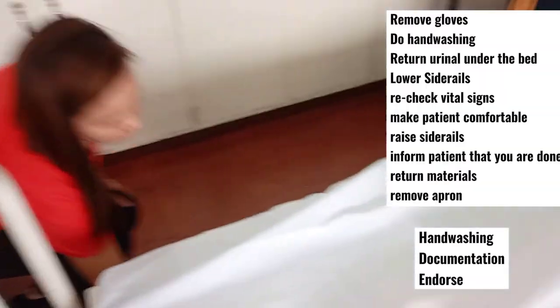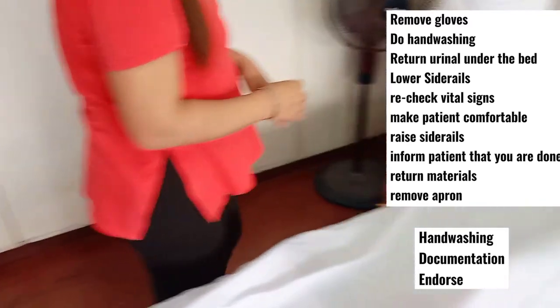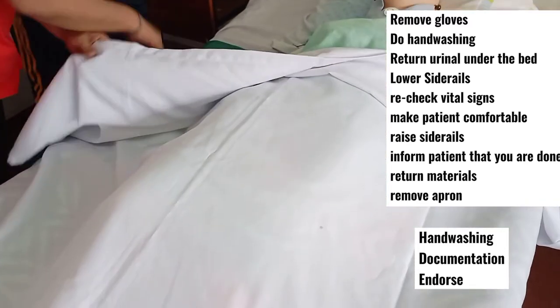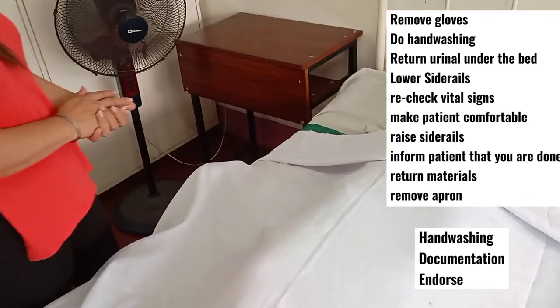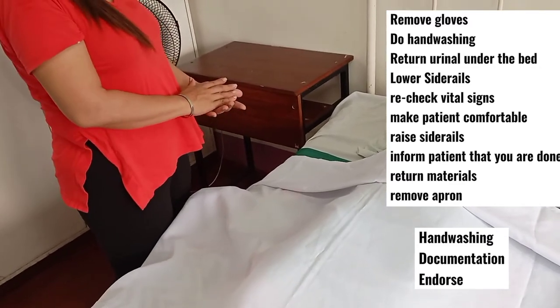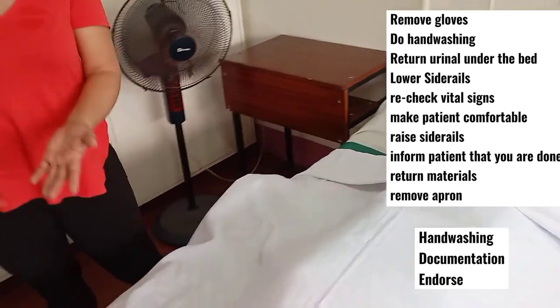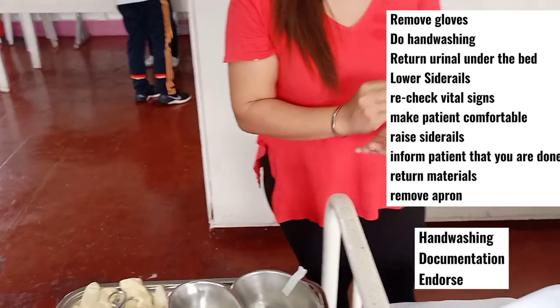Remove your gloves and recheck the vital signs of your patient. Make your patient comfortable and inform them that you are done: 'Ma'am, I'm done with your catheter care, I will go back later.' Return all materials, do proper hand washing, remove your apron, and complete the documentation.